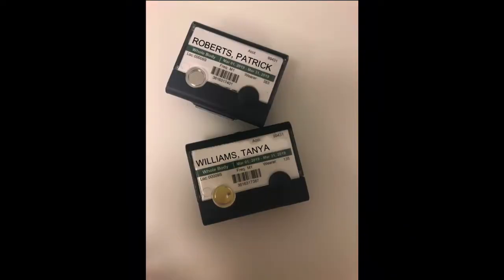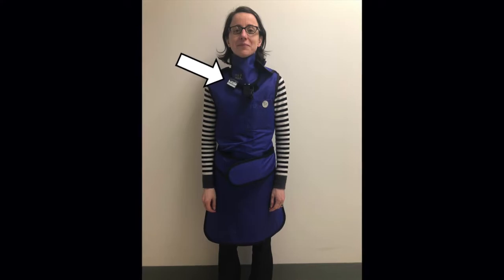While we do our best to limit our radiation exposure, dosimeters are used to monitor our cumulative exposure. They should be worn outside of the lead apron at the collar and should be kept outside of the bronch suite when not in use.